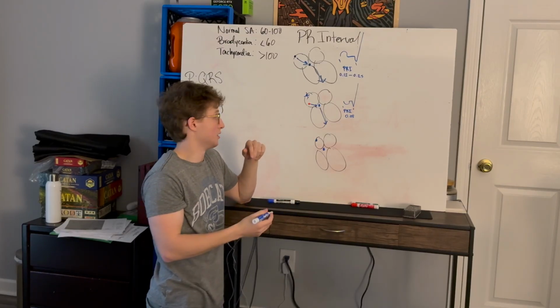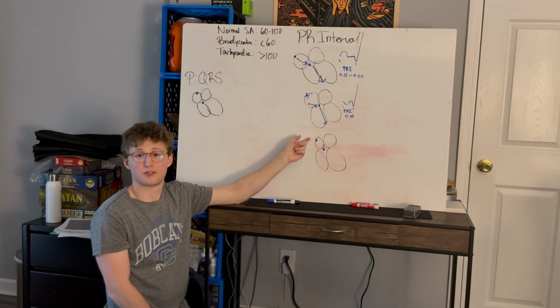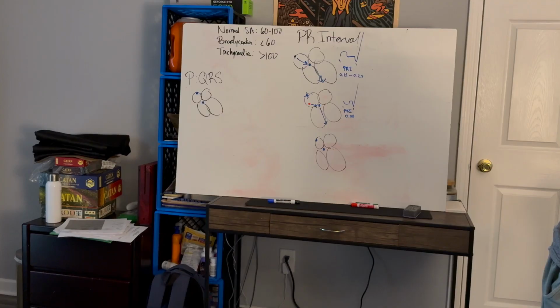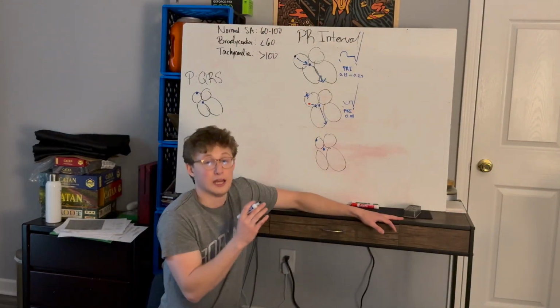What about a lengthened PR interval? So let's take AV blocks. So we'll use a first-degree AV block.